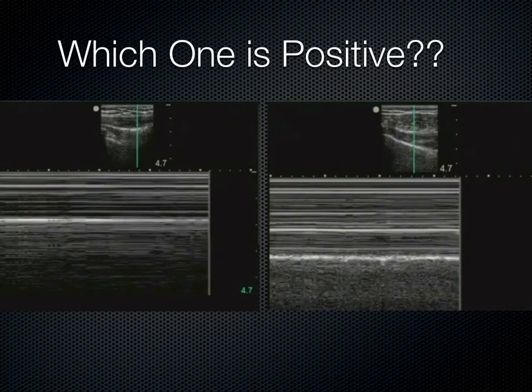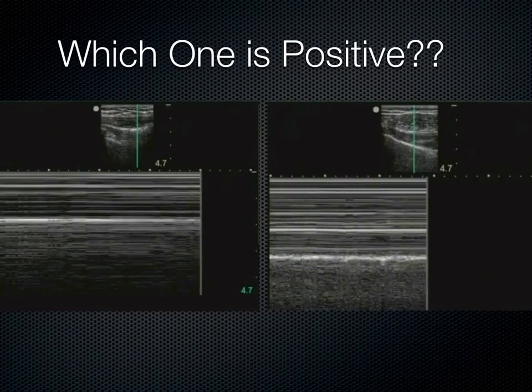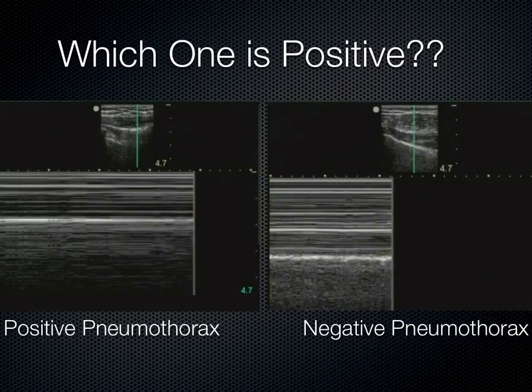And again, last examples, which one is positive? Right, so the negative pneumothorax again, Sky Ocean Beach.